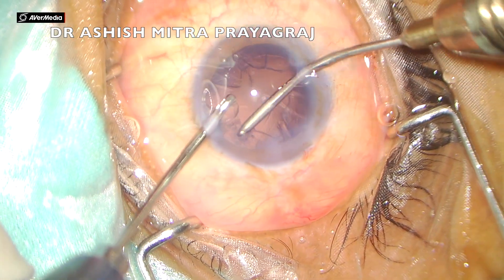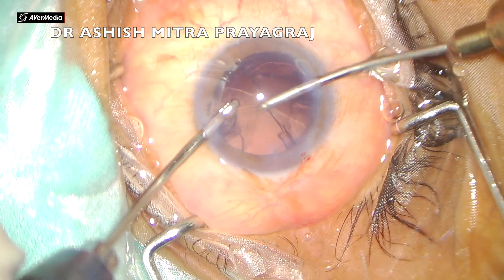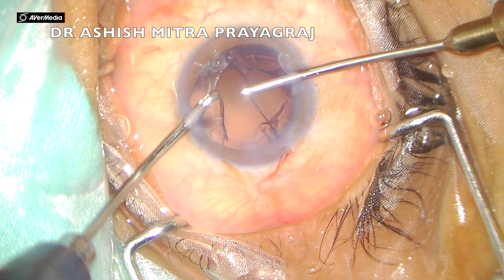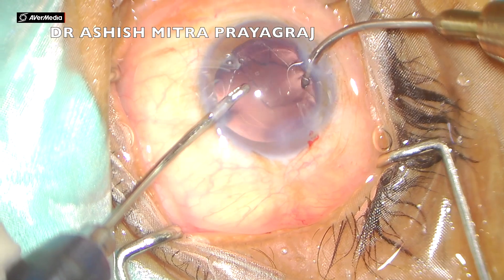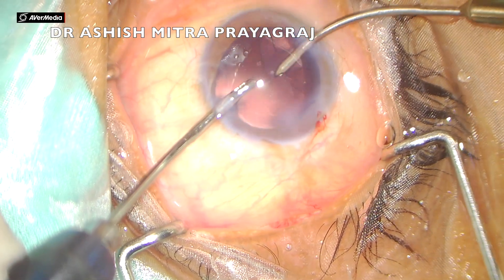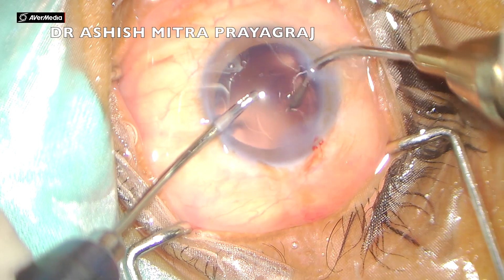Coming to irrigation and aspiration — I have fast-forwarded this because I have explained it in many of my videos. The principle remains the same: hold, bring it to the center, and then aspirate.